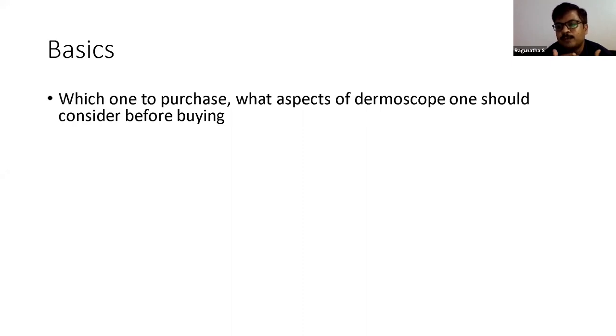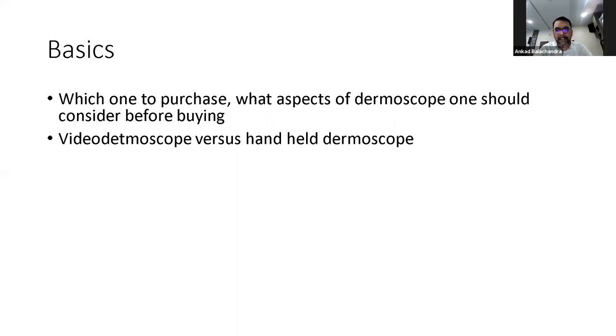So what is your suggestion? Yeah, dermoscopy is basically image-related practice, so the image should be good. And when we speak about publication, even better quality images should be captured, so a better quality dermoscope should be taken.